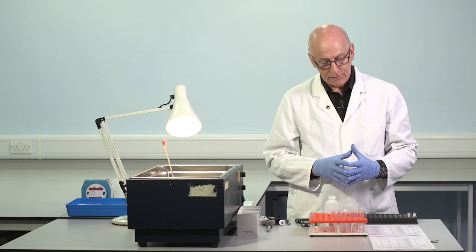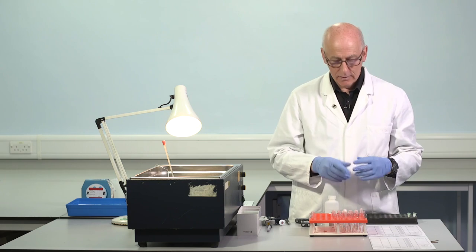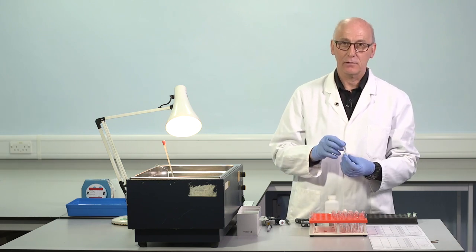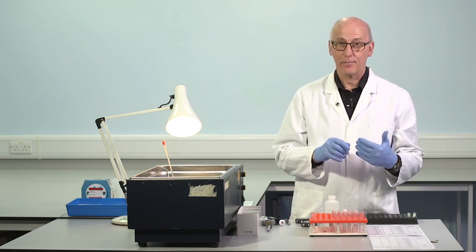So we need to check the levels of factor VIII now in each of the mixtures relative to the control mix. So we can use the control mix to construct a calibration line in the factor VIII assay.